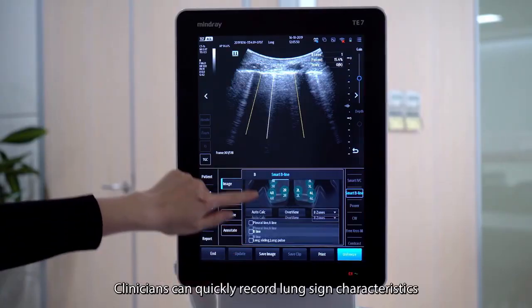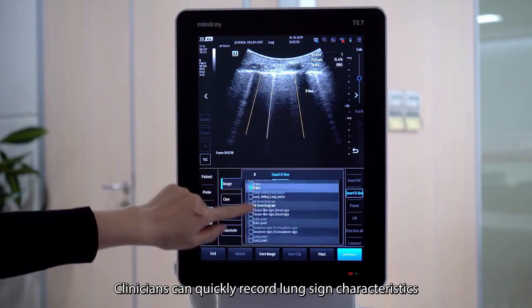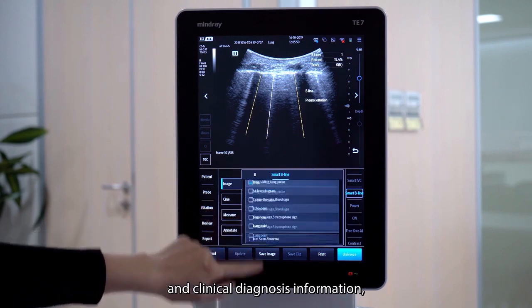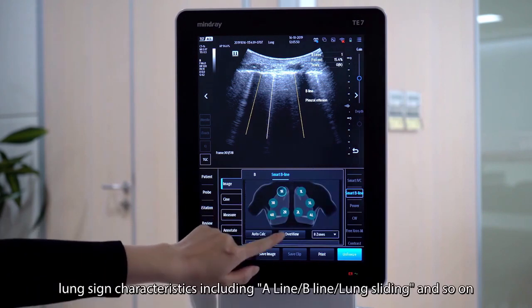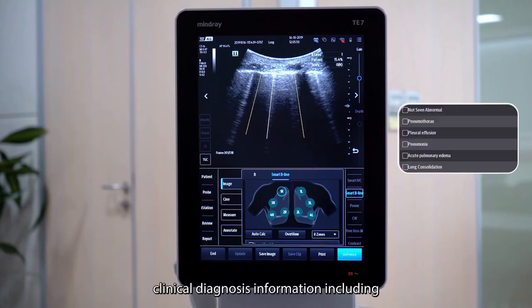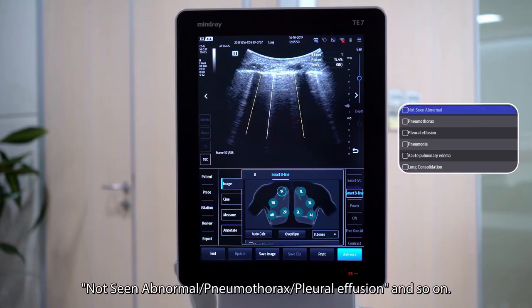Clinicians can quickly record the lung sound characteristics and clinical diagnosis information. Lung sound characteristics include A-line, B-line, lung sliding, and so on. Clinical diagnosis information includes normal, abnormal, pneumothorax, pleural effusion, and so on.